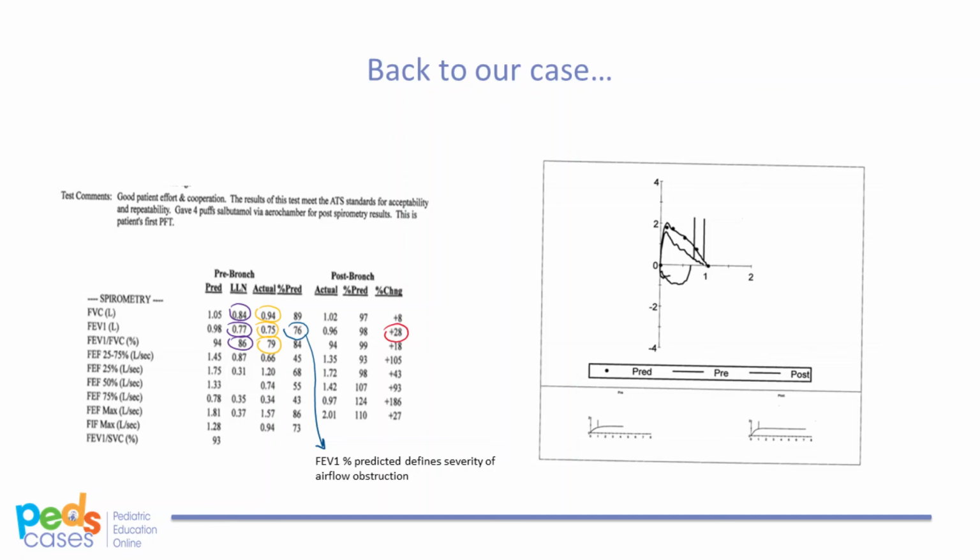You start her on a daily inhaled corticosteroid with salbutamol as needed and plan to see her back in follow-up in 3 months. At the follow-up visit, she says that her symptoms are significantly improved. She can now play volleyball without stopping to catch her breath. She is sleeping better at night and not waking up short of breath. You repeat the spirometry and find that her FEV1 over FVC ratio is now normal. Her FEV1 has significantly improved. Overall, there is clinical and spirometry improvement with asthma treatment.